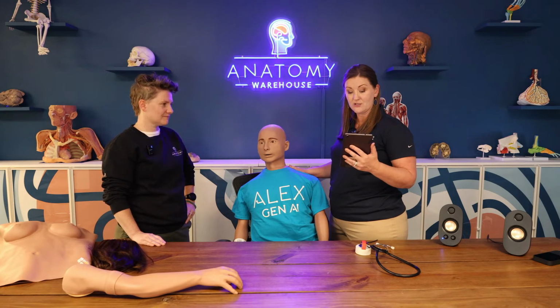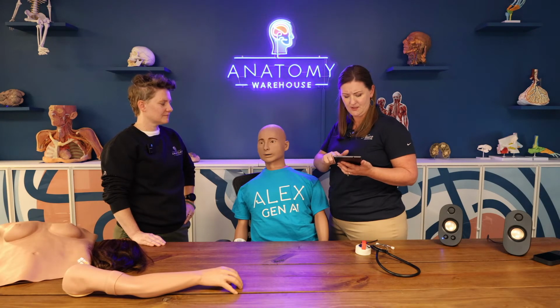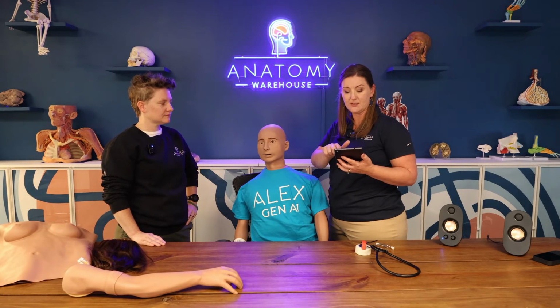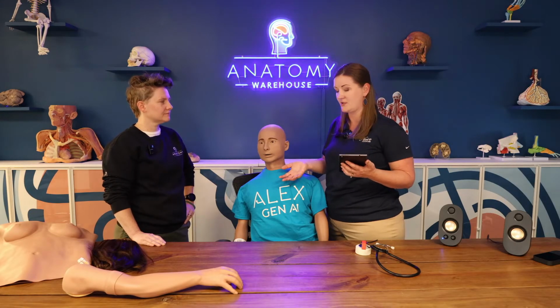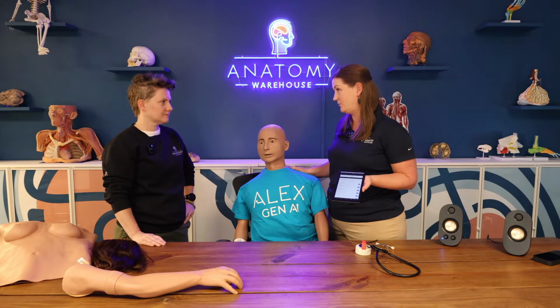The other thing that the software does really too is that you can do different things and go to different areas and show different assignments. You can also go back. The also key thing with the software platform is the ability to go back and take a look at what has been done with the mannequin, right?